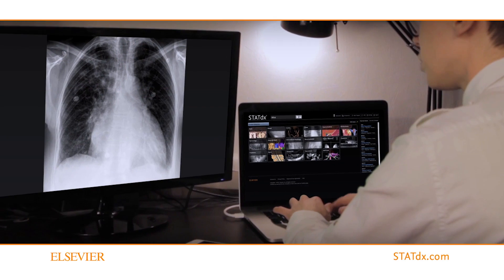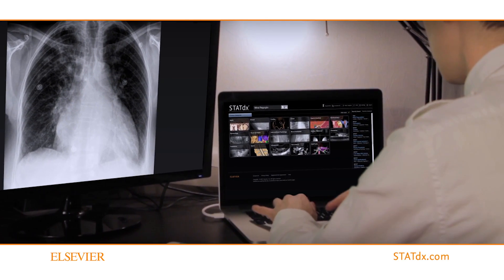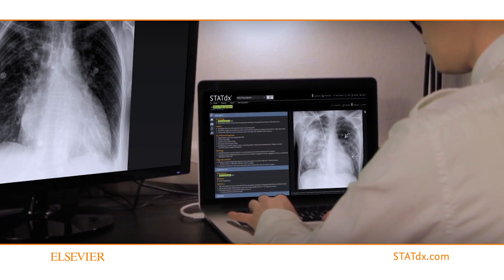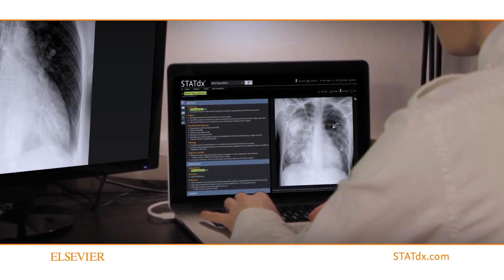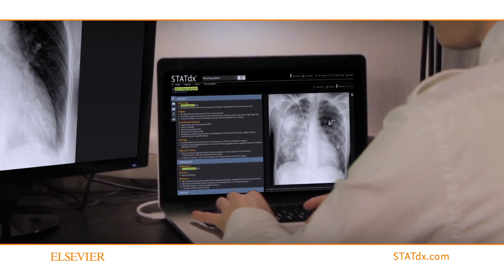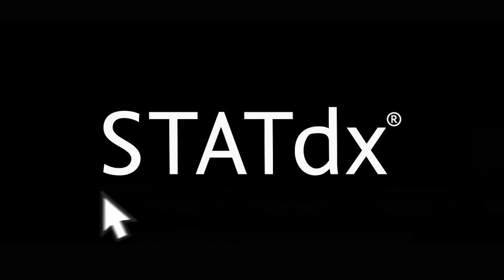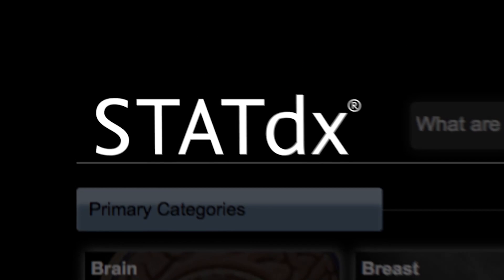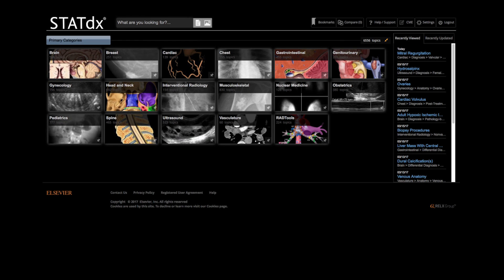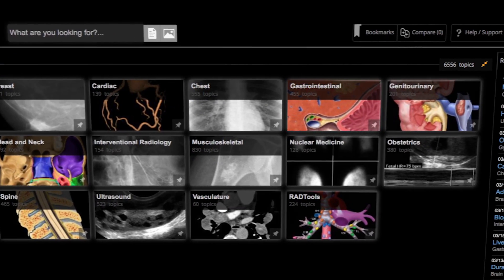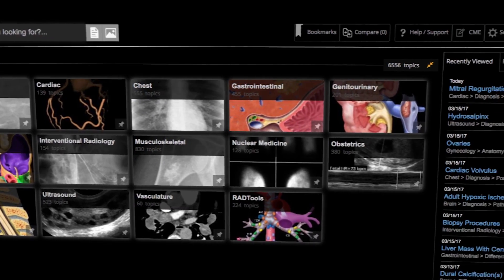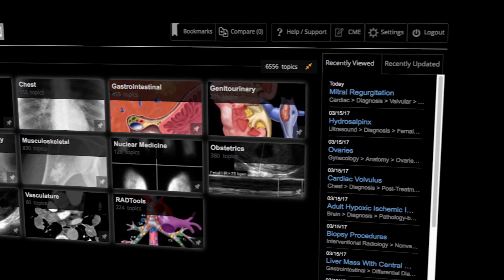STAT-DX provides comprehensive diagnostic decision support from renowned experts in every radiology specialty. Now let's take a closer look at what's inside. Whether you are a radiologist who is reading images in an unfamiliar specialty, analyzing a complex case, or teaching others, STAT-DX will help you deliver the best clinical decisions.